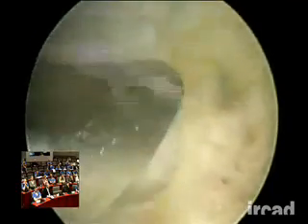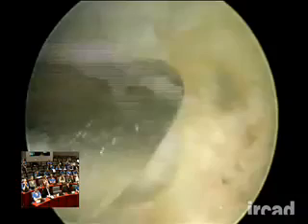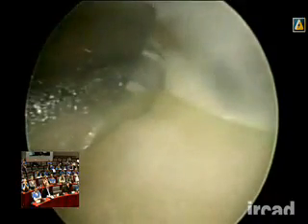Alex, do you always use the 1R and 1U portal, or do you change it with the portal of Slutsky or the volar 1? Sometimes I use a volar portal described by Orlando. Yeah. I used Slutsky's portal on 2 occasions because there's a large osteophyte that doesn't allow me to insert the usual ulnar portal. But normally this surgery can be done very easily with just 2 portals.